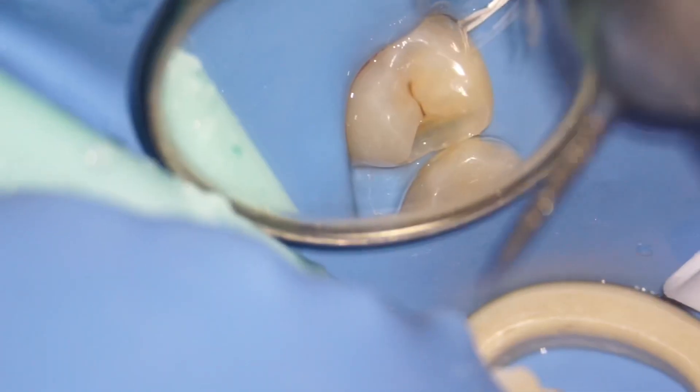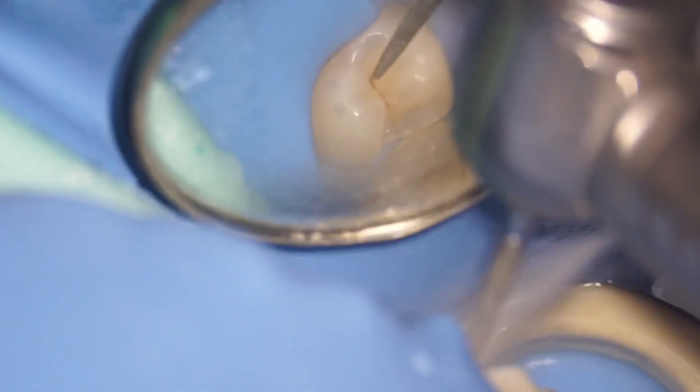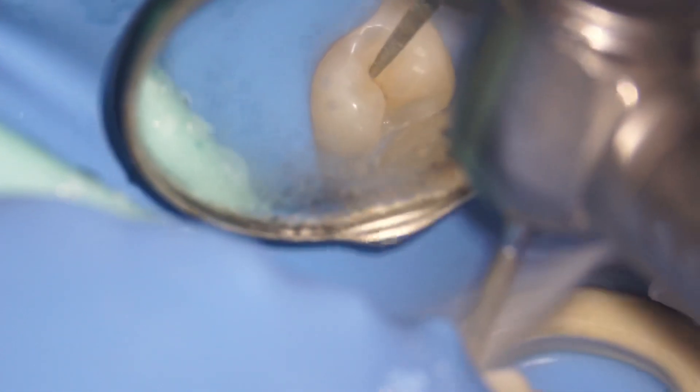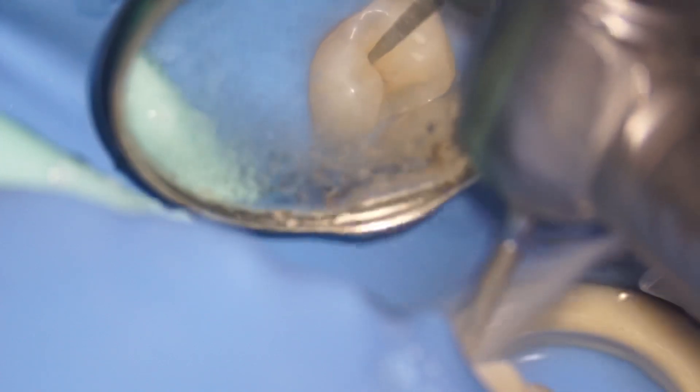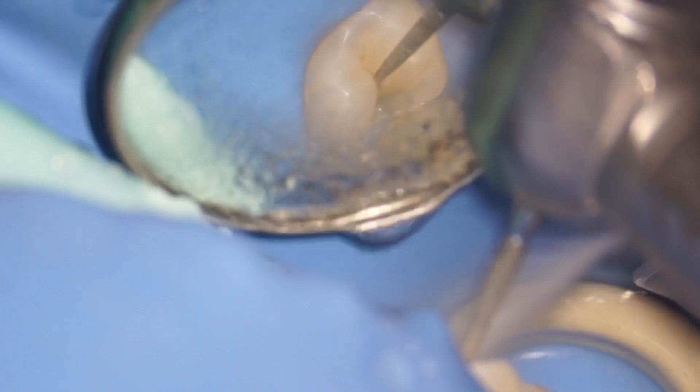I also use scalers a lot in my caries removal — not to remove caries of course, just to remove any food lodgement or any unsupported enamel. Then I'm going to use a needle bur to just remove the pit and fissure caries.